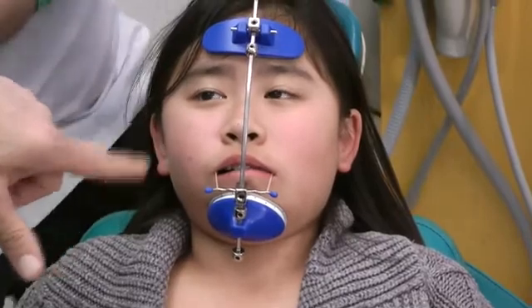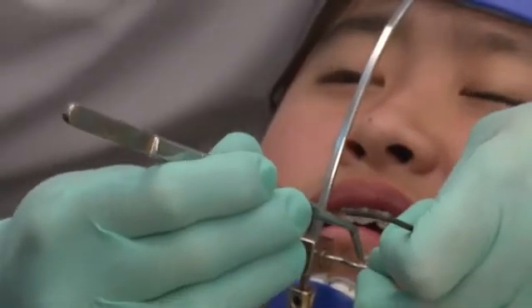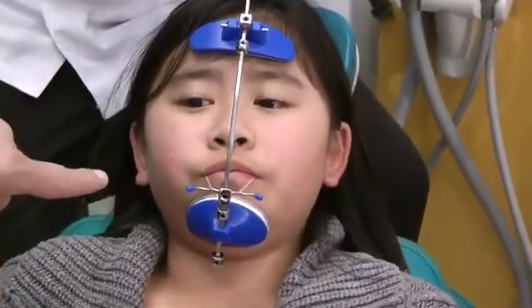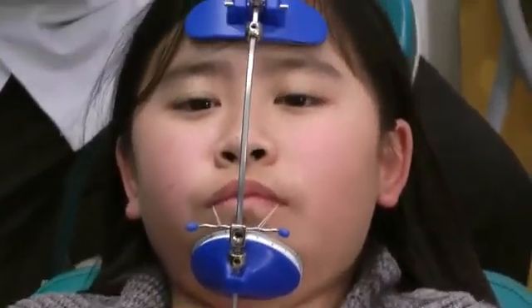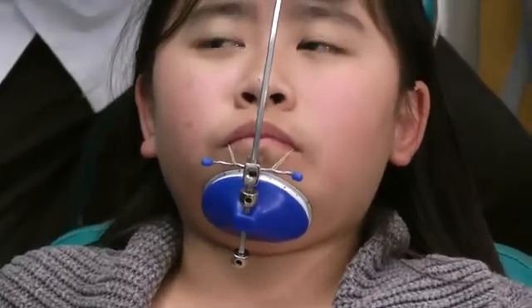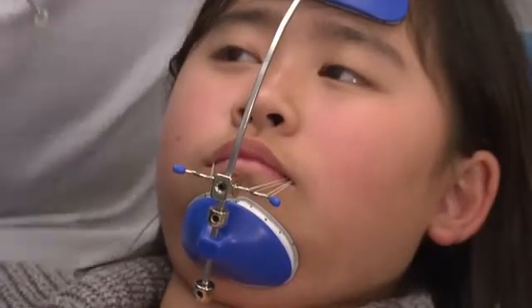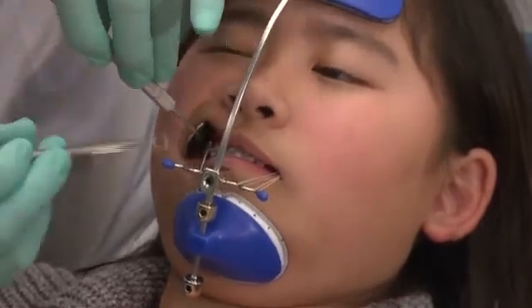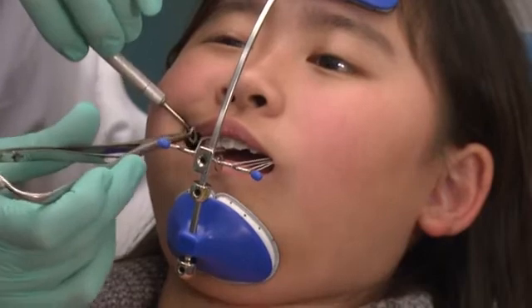If it was rubbing on the lip, we do a cross elastic. You do this one first before going full cross. By moving the elastics this way, we have less irritation. If you only have a certain number of elastics and force is dropping — say from 600 grams down to 300 — you can do a double elastic. We're now showing how to increase the force using the same elastics: two elastics in the form of a triangle. That gives a very good vector of force to keep pulling that maxilla downward and forward at 15 to 30 degrees with 600 grams of force.